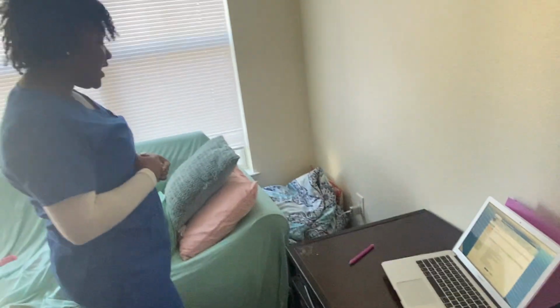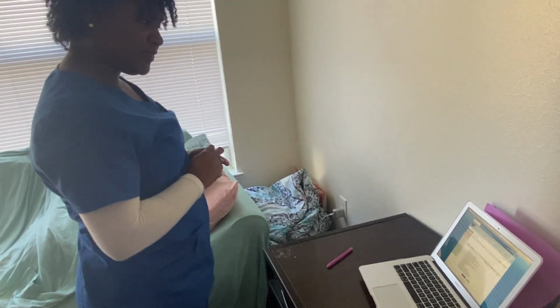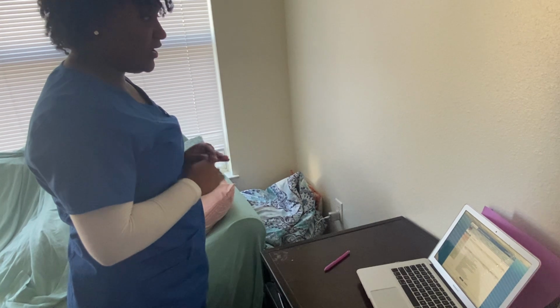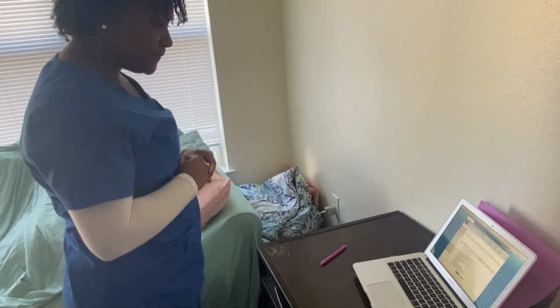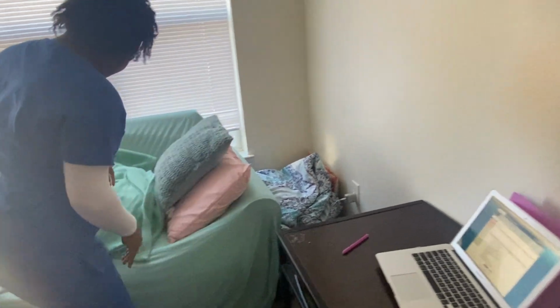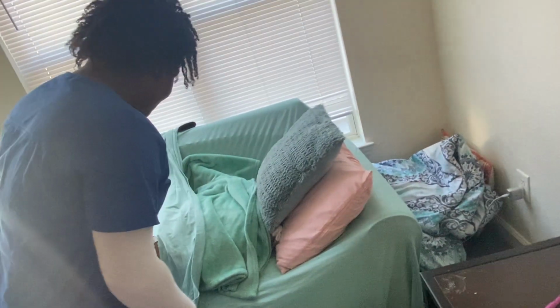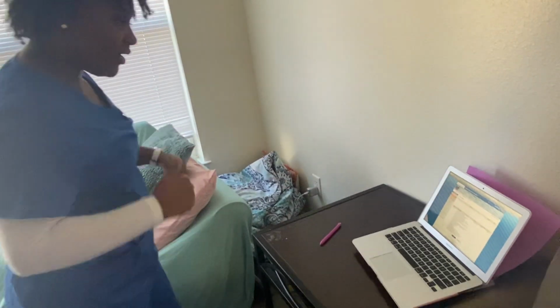Do you mind verifying your name for me? Bernadette Jackson. Okay, and how old are you? 85. Okay, do you have any known allergies, Miss Bernadette? No, ma'am, just a couple of seasonal allergies. Okay, and your MRN number is 7753214. Okay, so you are exactly who this chart says you are.